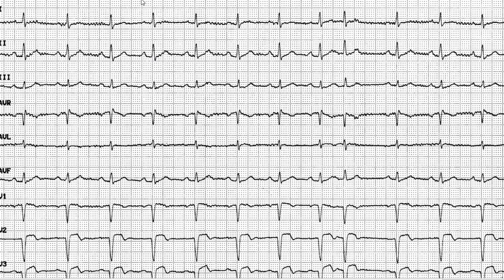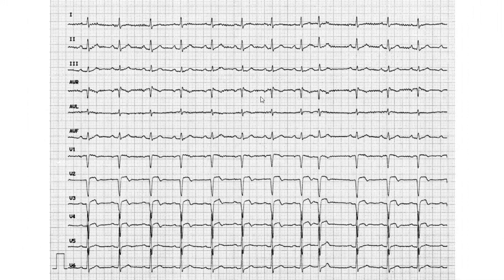You have to be a whole lot more accurate than I am, because I'm just trying to save time. But you will have all the time you need to be as accurate as you can, and you should be quite accurate. They say that they prefer that you are more extreme, or rather more insistent that there's a pathology.